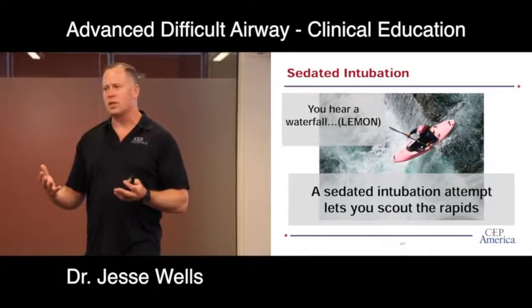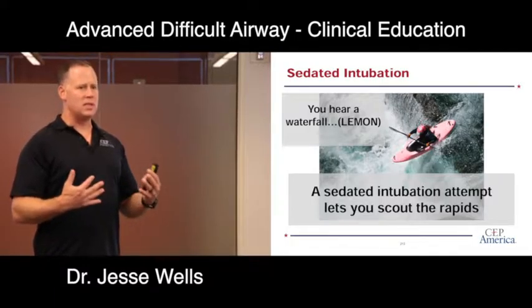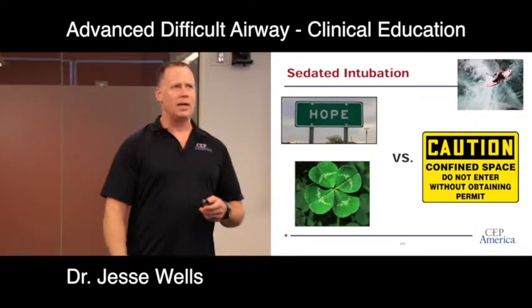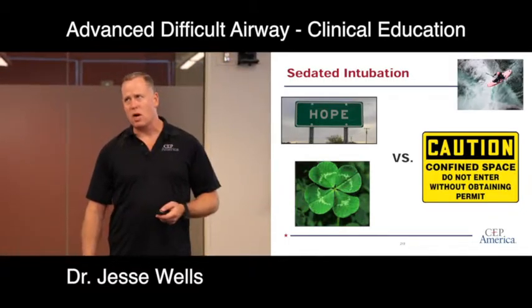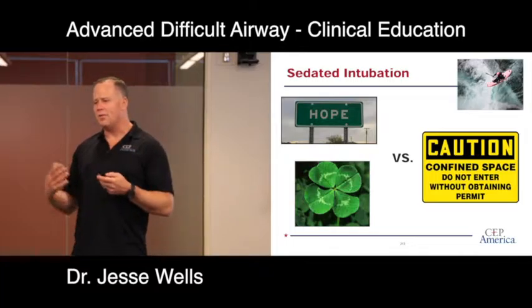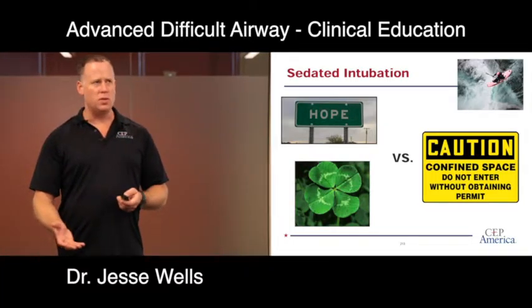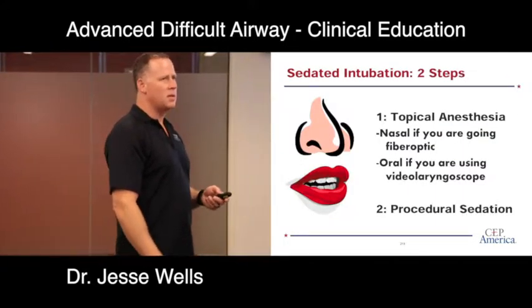And most of the time we were successful. But sedated intubation gives you a chance to scout the rapids to see if you can safely get past the potential issue. And it's a comparison between a strategy of hope versus a strategy of caution. And we have the equipment and the technology and the skill now to do sedated intubation, and that's what we should be doing for patients that are predicted to be difficult.